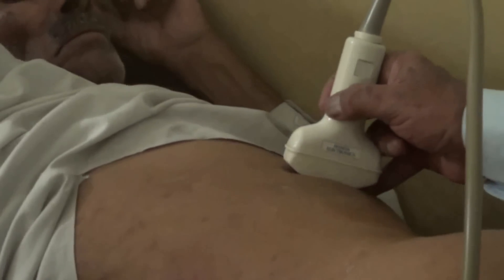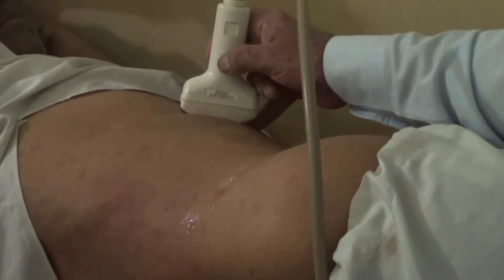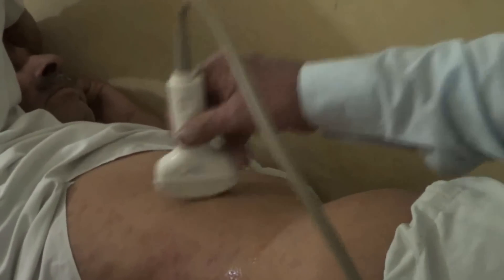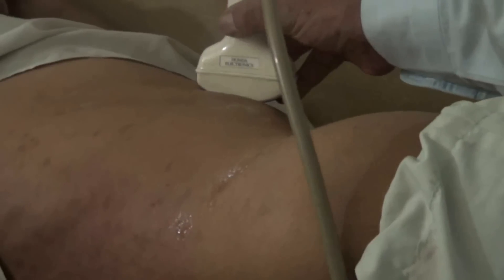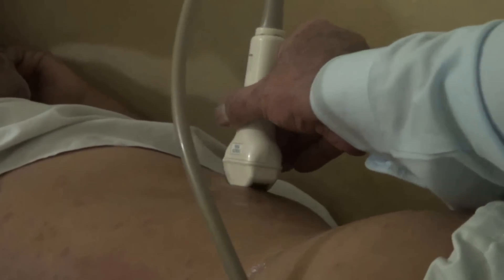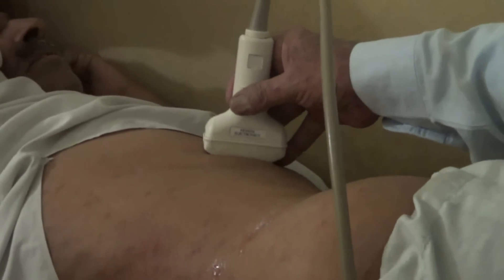This is the scanning plan of the video. The study patient is 40 years old, lying in left lateral decubitus posture. This is the subcostal region and these are the intercostal spaces. I will be moving up three to four fingers up in the intercostal space to show you the pathology, and we'll angle the probe straight or 90 degrees from here.